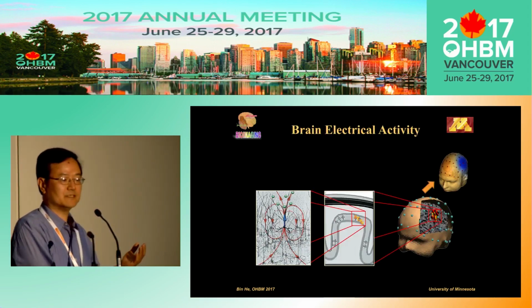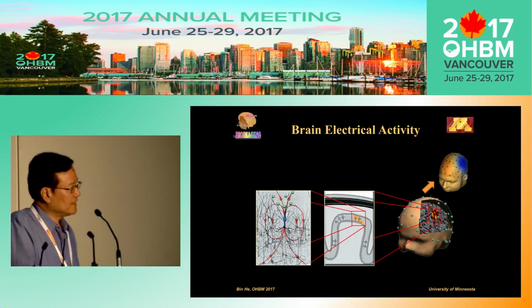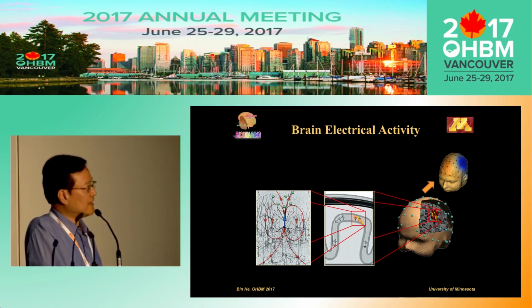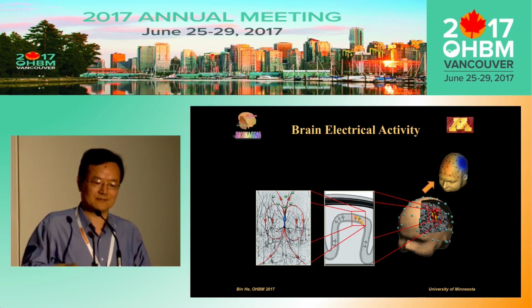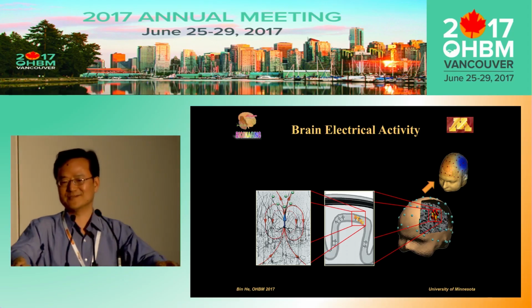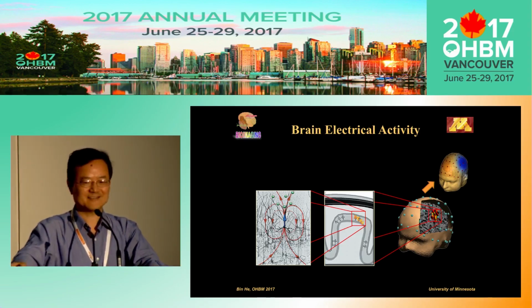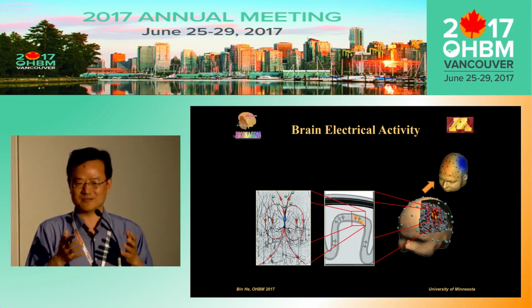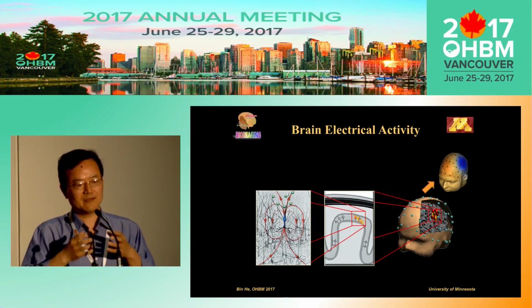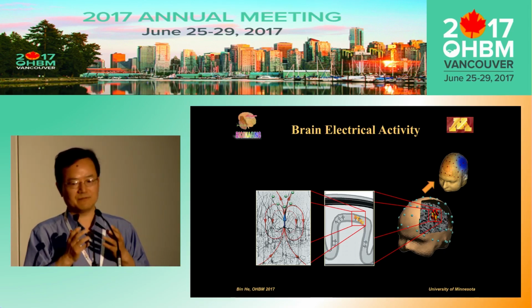Now, the second issue is source modeling. What is happening in our brain? This is just taking one example about the pyramidal cell and cortical source, cortical neural excitation. And I still recall Roberto Pascual-Marqui, long time ago in one of the workshops I organized, in 2000 in Chicago, he was explaining his LORETA, of which Christoph is a co-author, this famous LORETA work. The explanation is that you need to have a synchronized source.